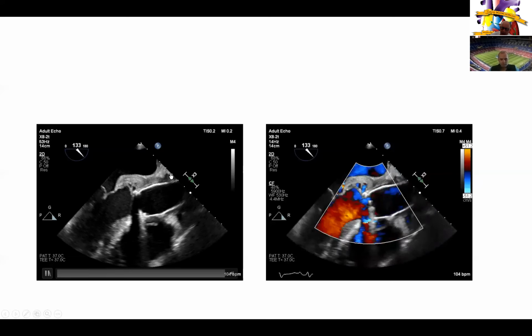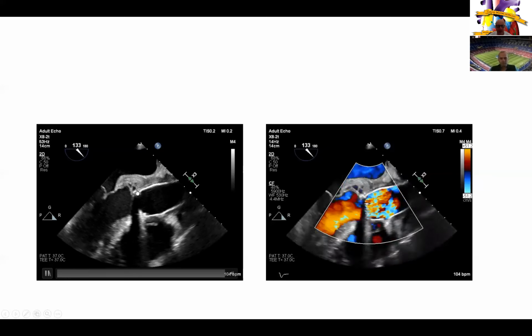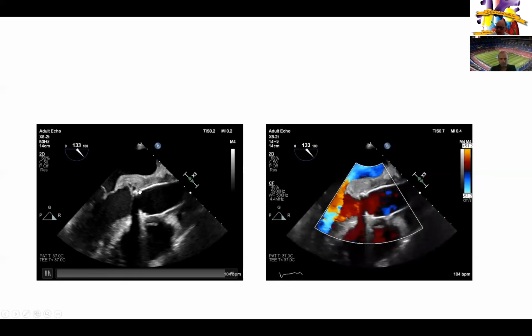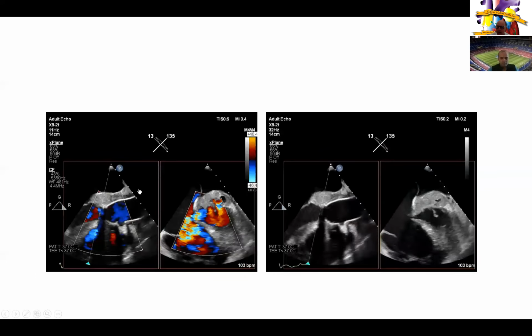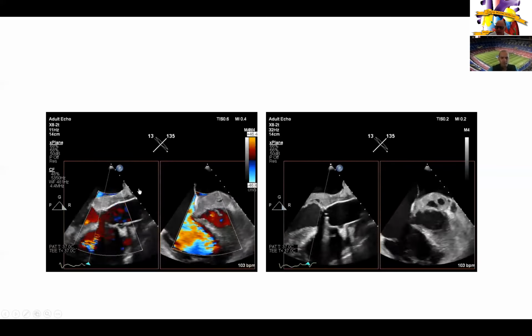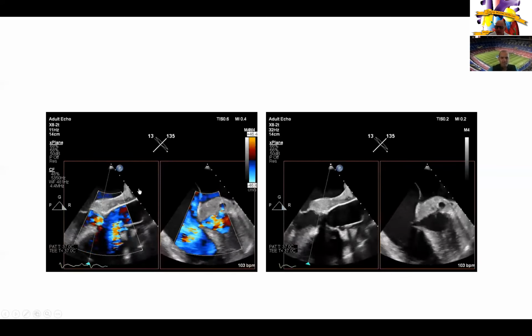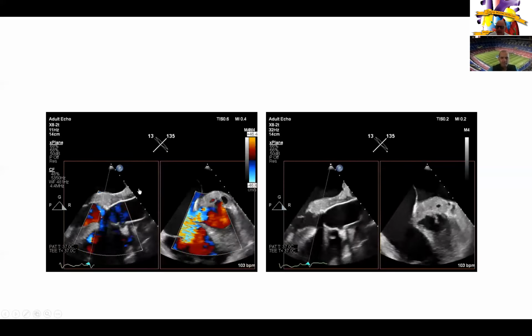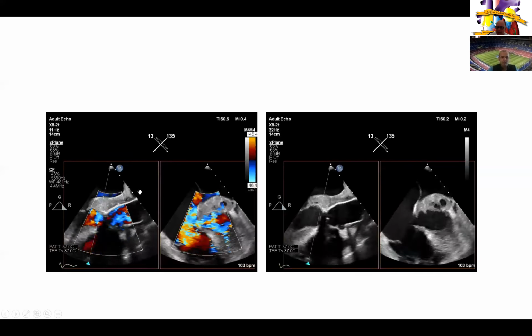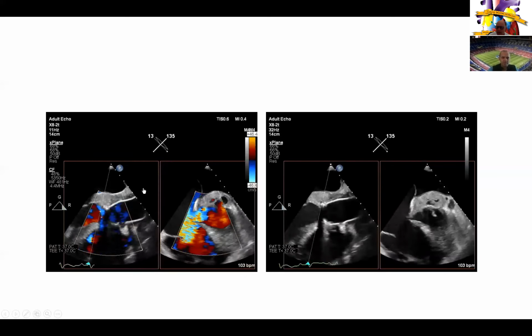That's something, again, that is disadvantageous for transthoracic echo because posterior structures are not well seen, and hence our inability to see it earlier. So here's another view of it. This is the advantage of biplane, where you just take a cross-sectional image of this abscess, and you can see on the right that associated with the abscess, there are mobile vegetations sticking from that posterior aortic root abscess.